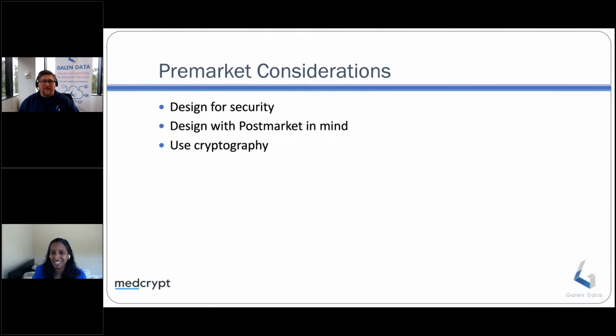Tim alluded to the scope of the guidance with devices in particular. This version of the guidance explicitly calls out these pre-market devices. It used to be that just the 510(k) type of submission required it, but we're seeing it for PMAs, for IDEs, where you just have 10, 12 devices in the field for clinical purposes, needing to demonstrate some intentionality around cybersecurity. And that's a huge deal for folks who are just starting out on their journey towards building a mature device.